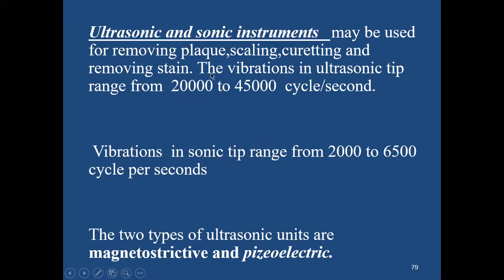The vibrations in the ultrasonic tips are from 20,000 to 45,000 cycles per second. The vibration in the sonic is from 2,000 to 6,500 cycles per second.